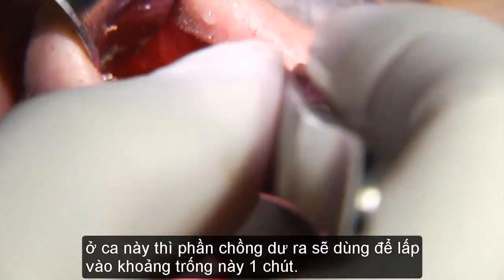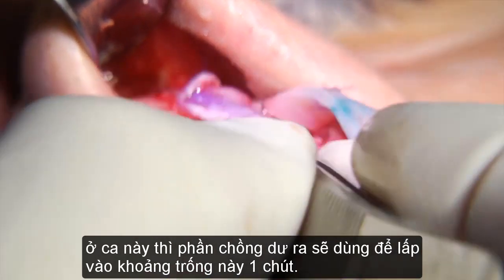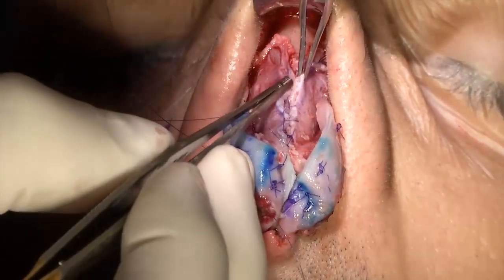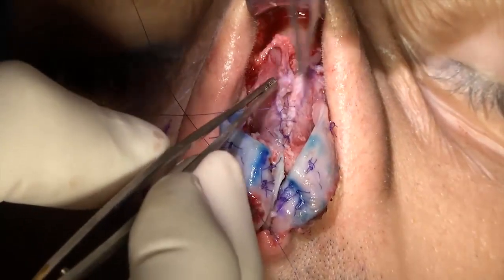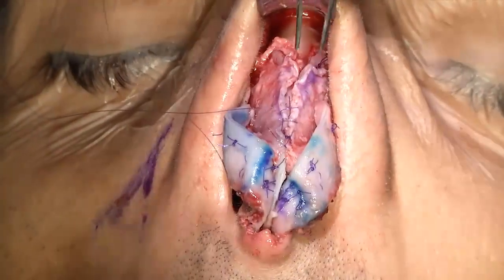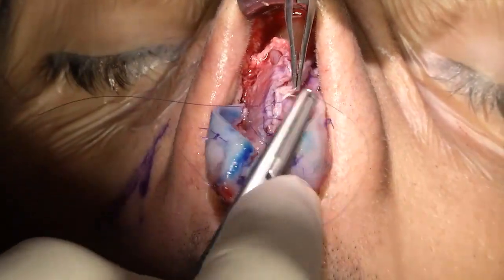In this case, this overlap is good, since I will use it to fill this gap a little bit, okay? I will double breast it. Double breast.